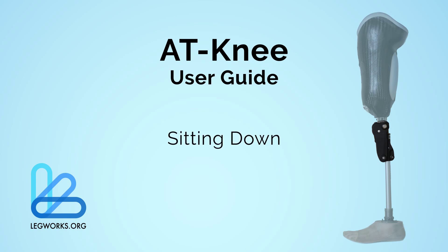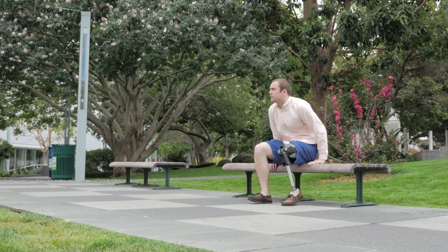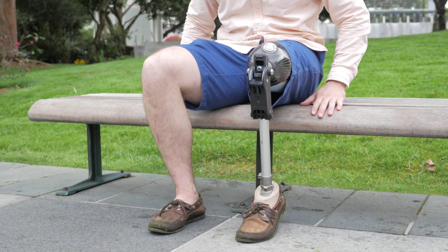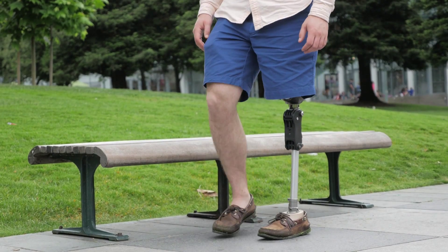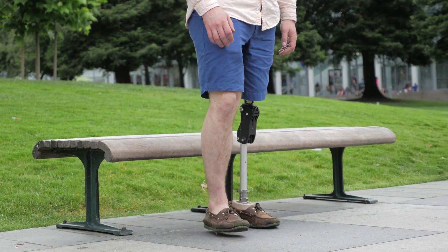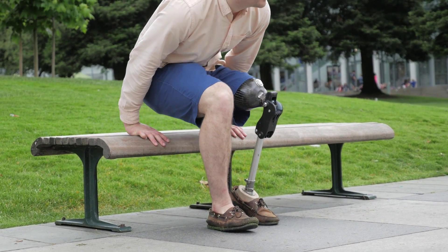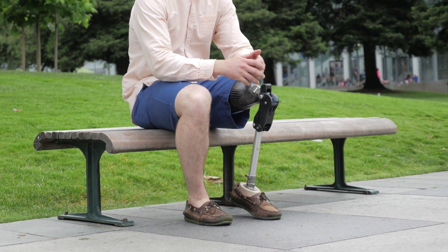Sitting with the AT-Knee can be easily done. For lower activity level users or for bilateral amputees, it is encouraged to use a seat with an armrest. To sit, put your prosthetic leg slightly behind your sound leg, grab onto the armrest or the seat, place weight onto the toe of your prosthesis to disengage the ASPL mechanism, and slowly lower yourself down with your sound leg and arms.